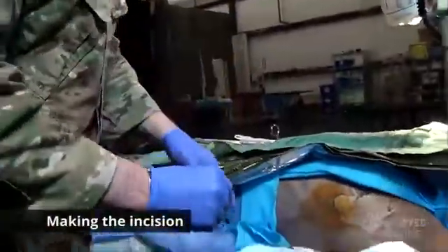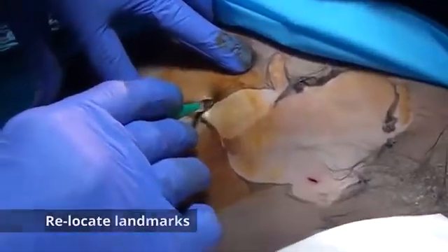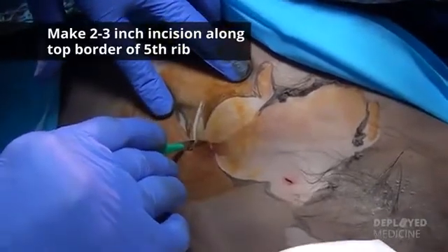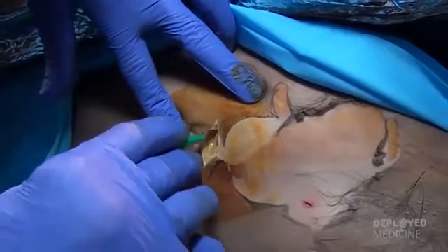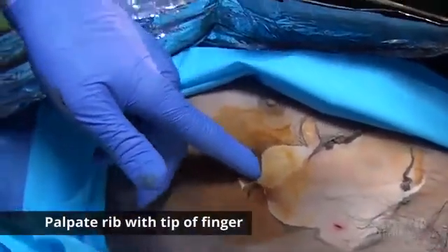All right, the next step is to go ahead and make our incision. Go ahead and take your blade, find your landmarks, make a 2 to 3 inch incision down to the rib. You'll feel the rib there.